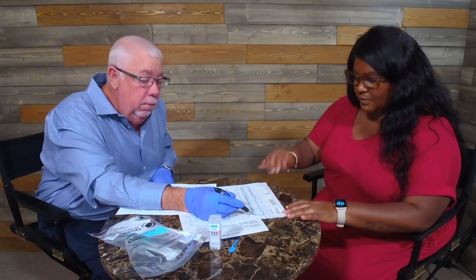I'm going to have you print your name, sign your name, and put today's date. You're certifying that this is your specimen, that we're sending it out for a drug screen. And you're going to do that right there in step 5, right? Okay. Donor section. Okay, and I'm going to sign off as the collector with my phone number. Signature of collector. Print my name. And the specimen is going to be released to FedEx. I'm going to add the time of the collection and the date of the collection. Okay. And this very top copy is going to be going out to the laboratory.